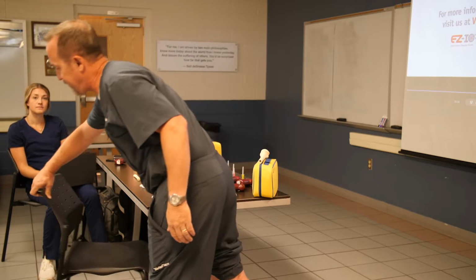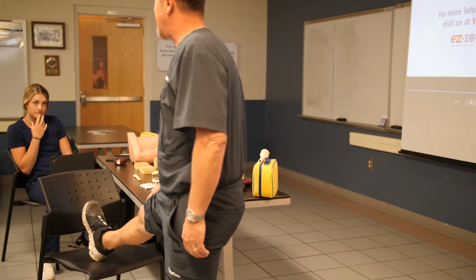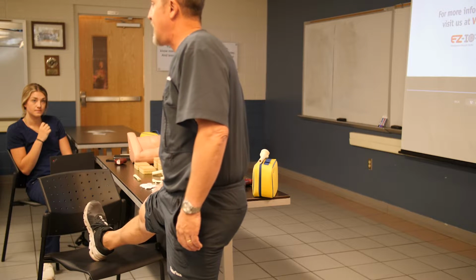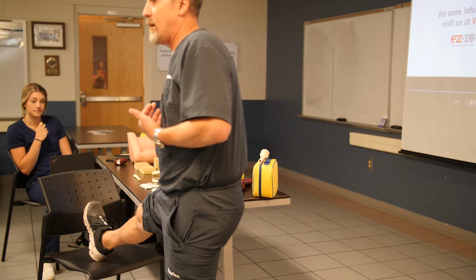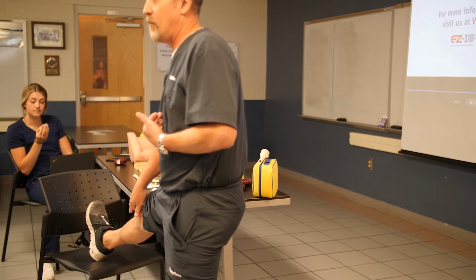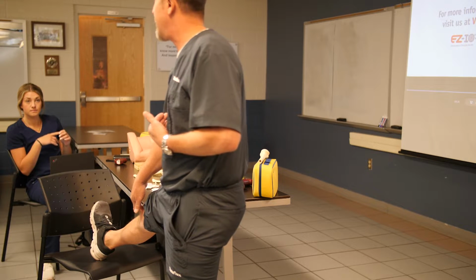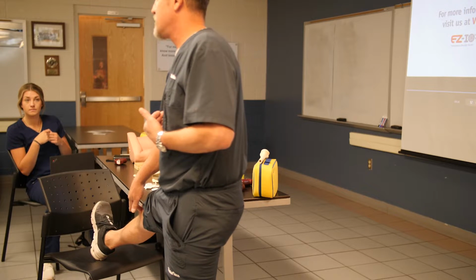So we can utilize the femur, which is the biggest bone in the body, and what we're going to do is we're going to have their leg extended again. We're going to identify their patella, and we're going to use the same landmarking technique, but we're going to go proximal to the patella. So we're going to go about 1 to 1.5 above the patella, and then about 1 centimeter medial. And we'll just go into that medial condyle. Does that make sense to everybody? So really easy.